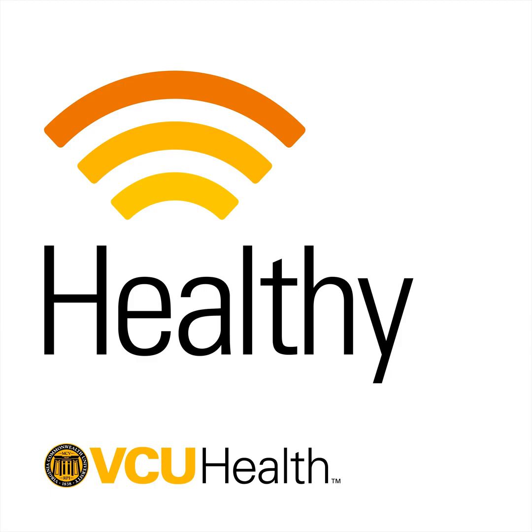What are some of the other benefits of focused ultrasound? A couple. As I mentioned, it's done as an outpatient procedure. So you don't need to be in the hospital for several days, which is what you would need for deep brain stimulation. You come in the morning and you're done by lunch. So that provides a significant advantage, particularly to people who may have a lot of comorbidities, that being in the hospital poses an elevated risk to them.